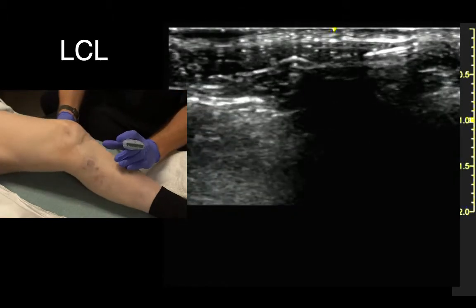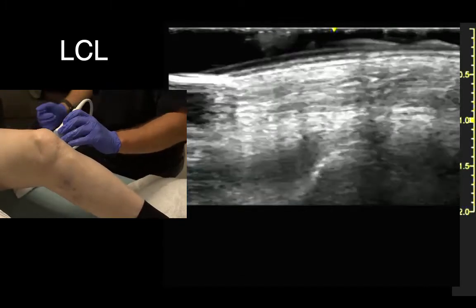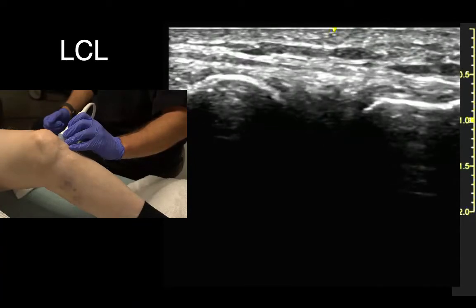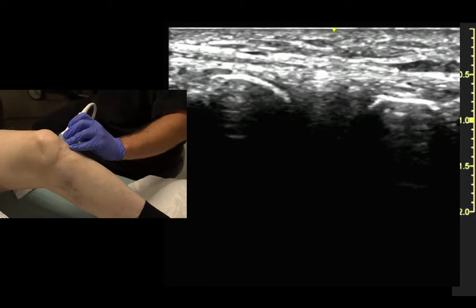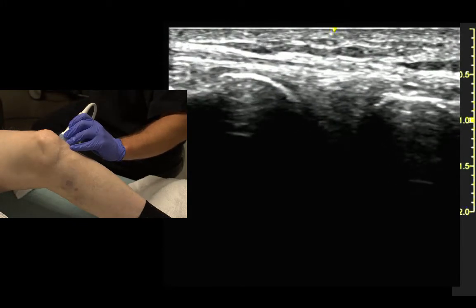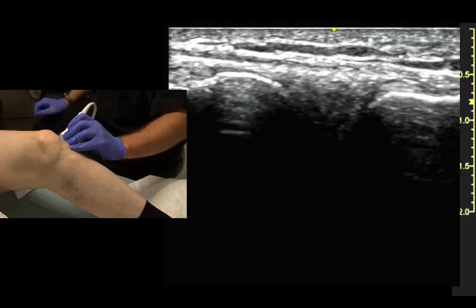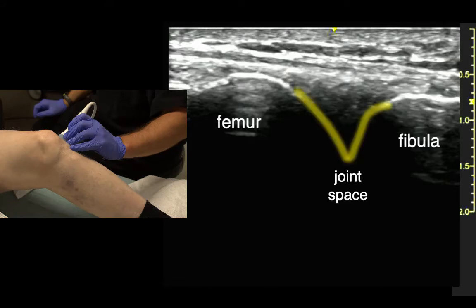For the LCL, we find the joint space again. The ligament is a lot thinner on this side. We identify the joint space first — there's the ligament right over top, it's pretty thin.